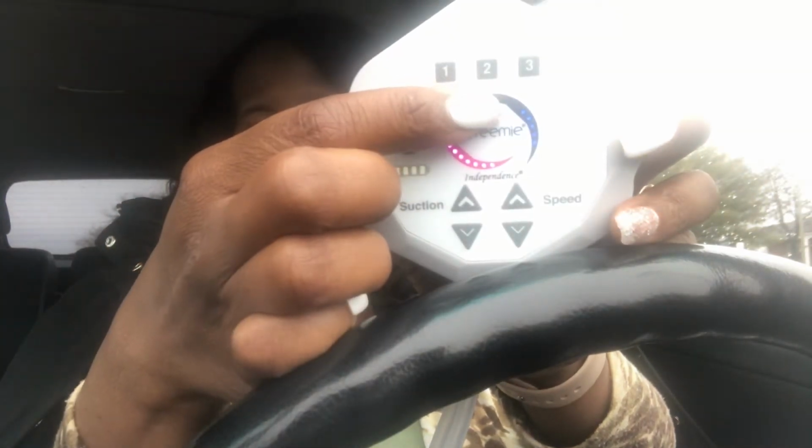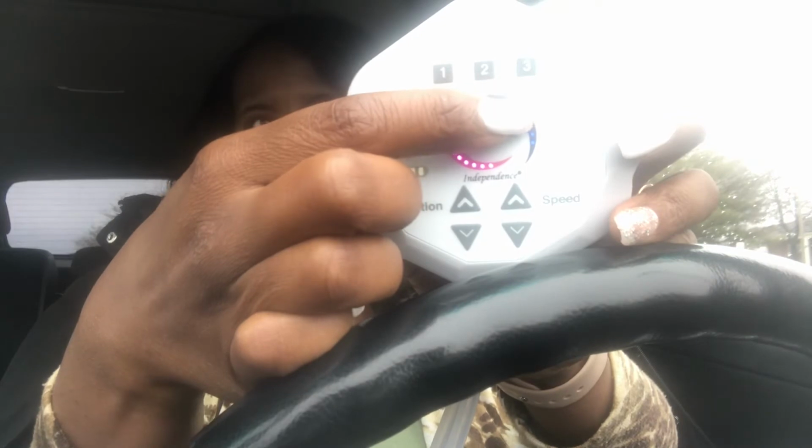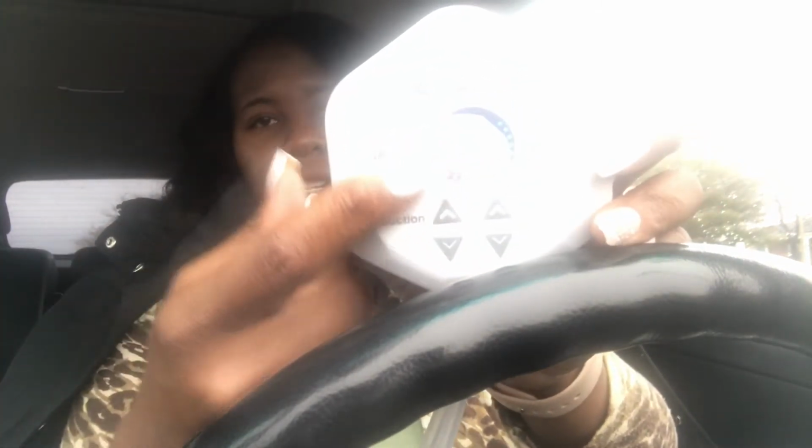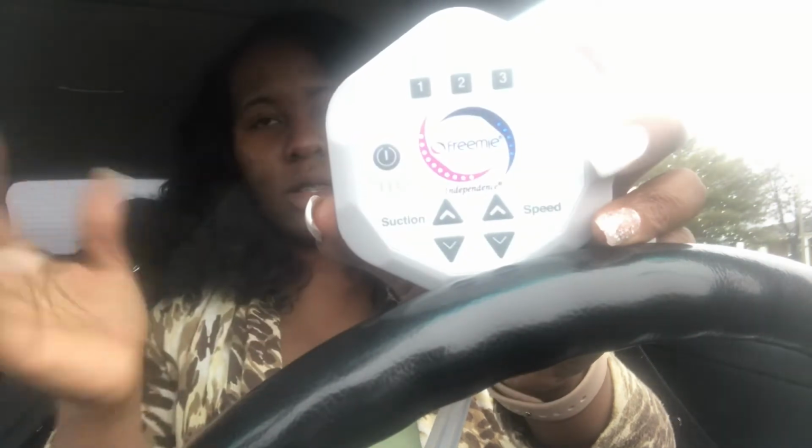I usually pump at level 2 for the longest. 3, I will only do sometimes if I'm in a hurry, or if I just feel like number 2 is not doing it that day, because you know the baby drinks different. I guess the pump needs to be different sometimes, but typically that's the order I do: 1, 2, sometimes 3.